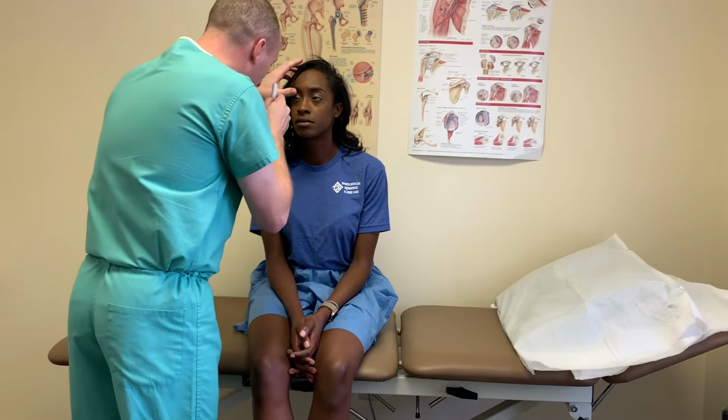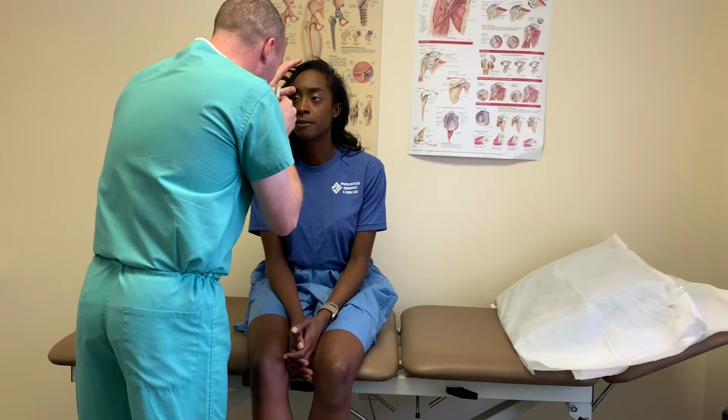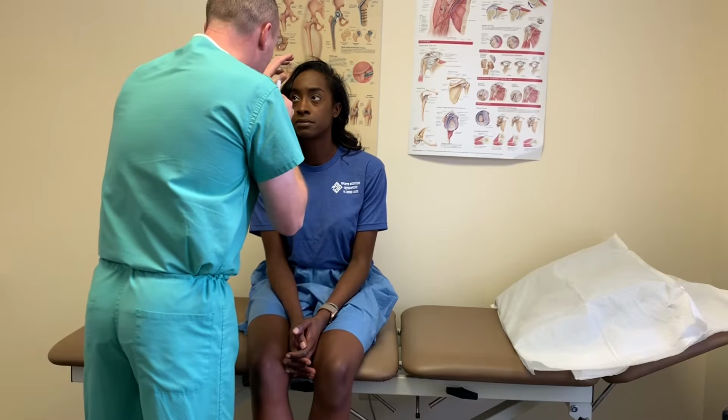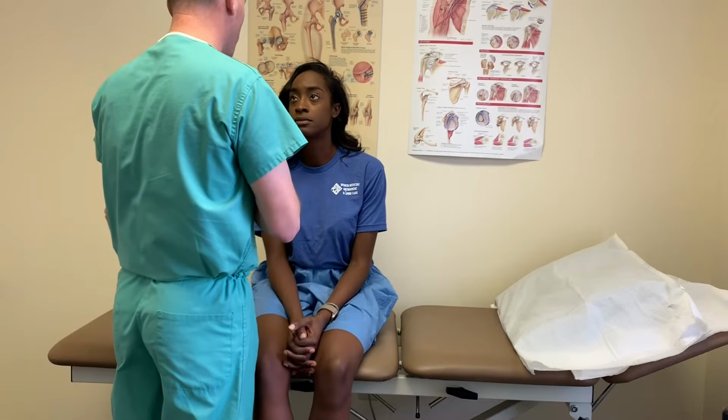I would take the red reflex and try to visualize the optic disc. I'm looking for normal vessel size. I'm looking for any evidence of papilledema, and I'm just trying to view the optic disc and the cup and make sure the structures of your eye are normal through a fundoscopic exam. Okay? Thank you.